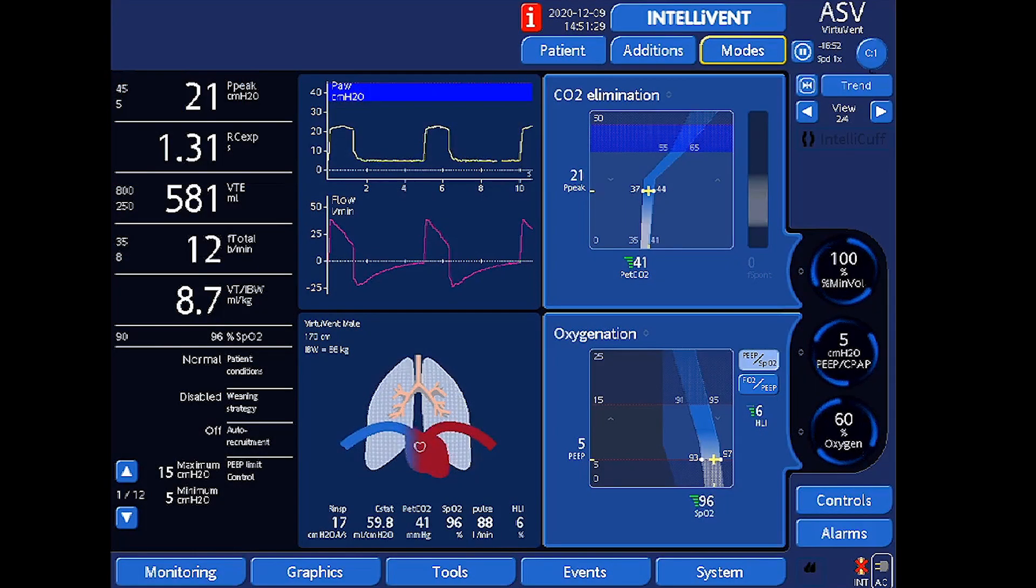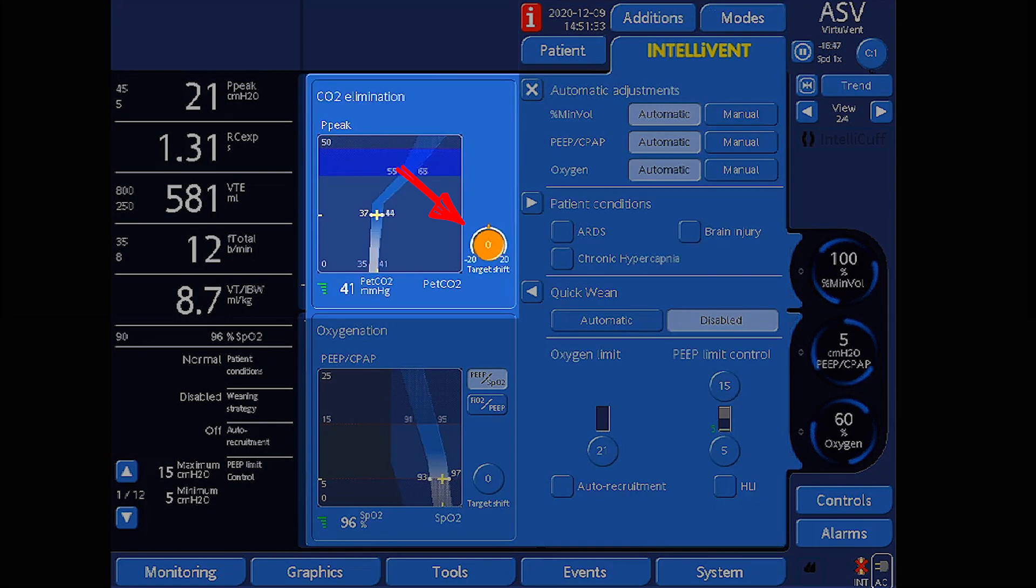To do this, open the IntelliVent ASV settings window and select the target shift control in the CO2 elimination window. You can adjust the PET CO2 target range to the left for lower values or to the right for higher values within the defined limits. In this case, we want to reduce it by 10 mmHg to achieve the desired PaCO2 goal.